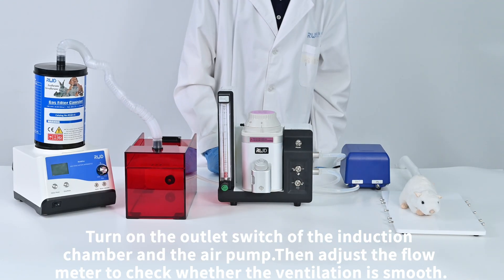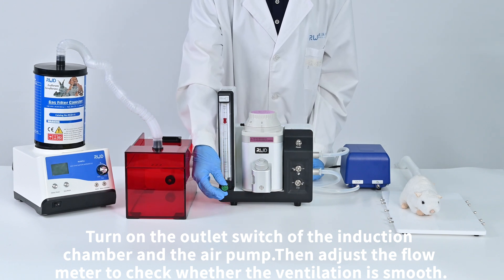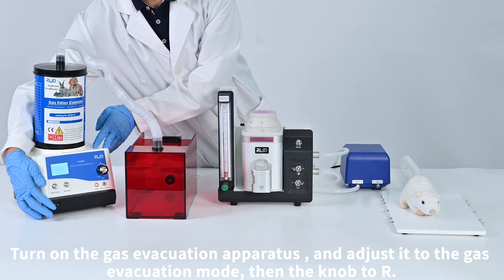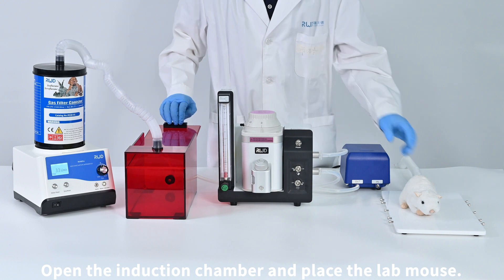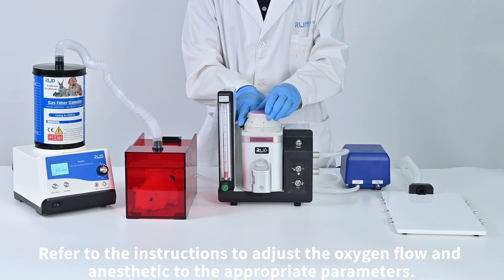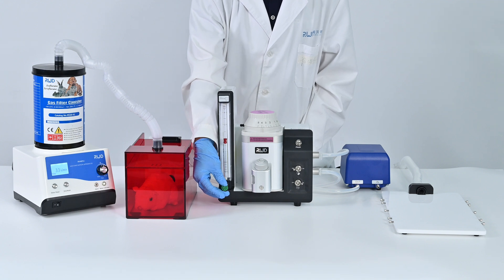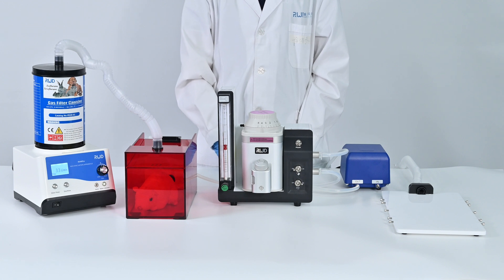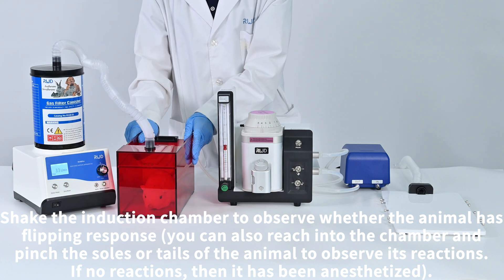Turn on the outlet switch of the induction chamber and the air pump, then adjust the flow meter to check whether the ventilation is smooth. Turn on the gas evacuation apparatus and adjust it to the gas evacuation mode, then set to R. Open the induction chamber and place the lab mouse. Refer to the instructions to adjust the oxygen flow and anesthetic to the appropriate parameters. Shake the induction chamber to observe whether the animal has a righting response.